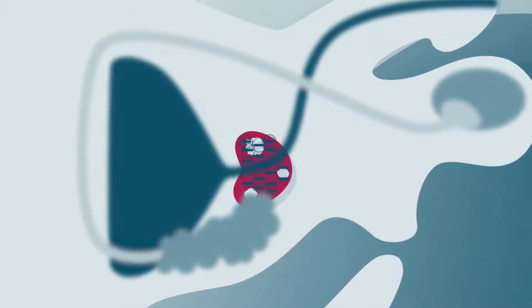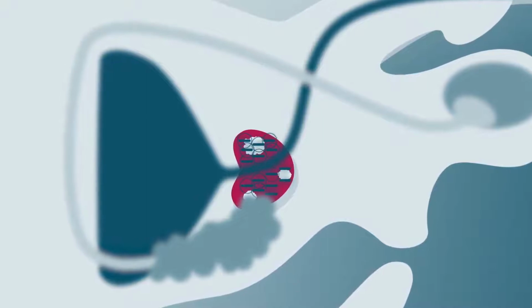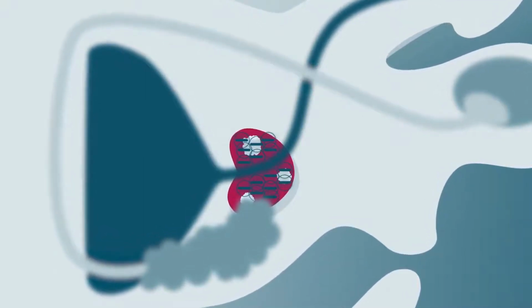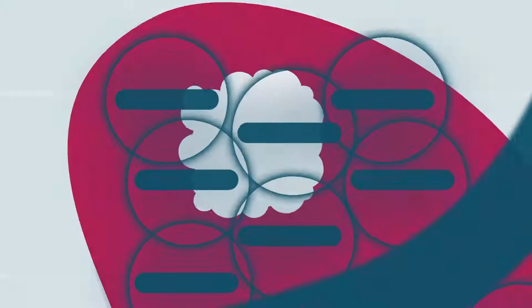In contrast to the nerve-preserving surgery, this procedure also easily allows the treatment of the area surrounding the prostate and thereby enables a significant improvement of the chances of recovery. Cancer cells react more sensitively to radioactivity than healthy cells and can be killed by exposure to radiation. The isotope iodine-125 is generally used for the seeds.